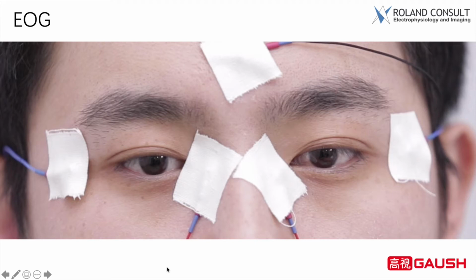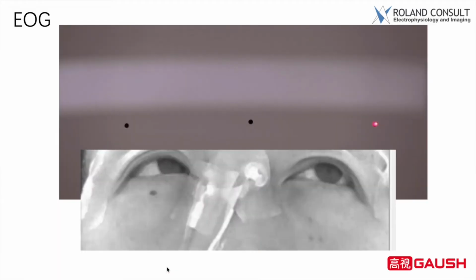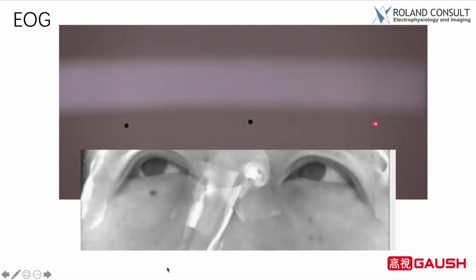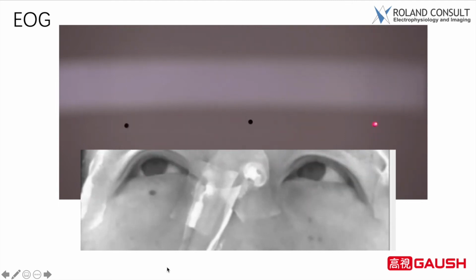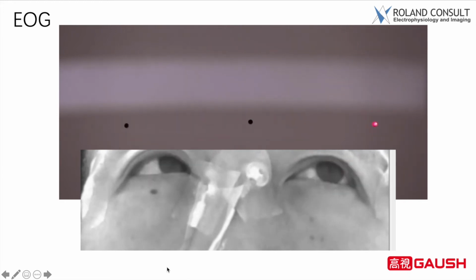The 2 electrodes in the inner canthus of both eyes are located equidistant from each other on either side of the nose. Both eyes share a grounding electrode, which can be placed on the forehead, top, earlobe or mastoid. Before the formal examination, ask the patient not to move his or her head, but to move his or her eyes to the left or right side and fix on the fixation point light. It is necessary to practice before the examination, and you should get a stable and high-quality waveform before the formal examination.